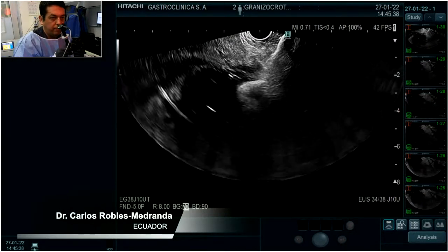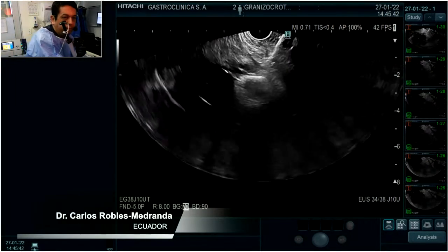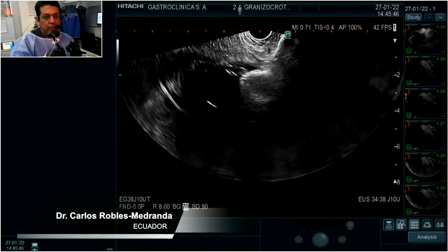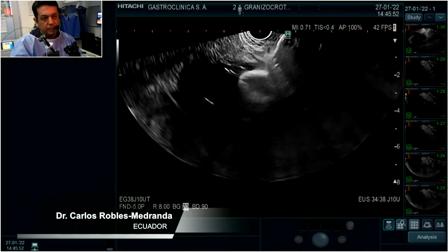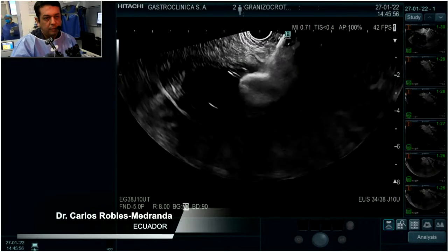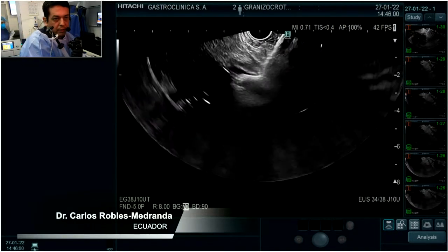You see? Very well. So now I open, and I am inside the collection, okay? So I will try to push a little bit more. And now, as you can see here, I am pushing. Look.